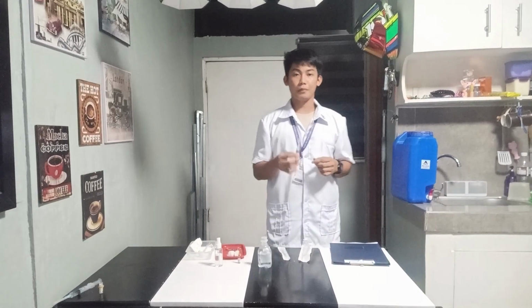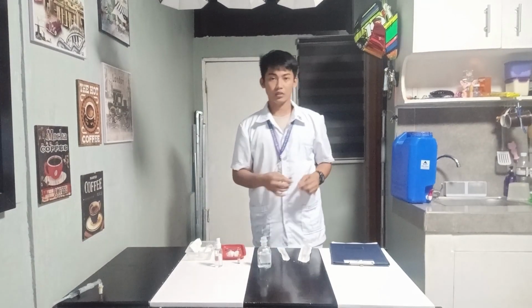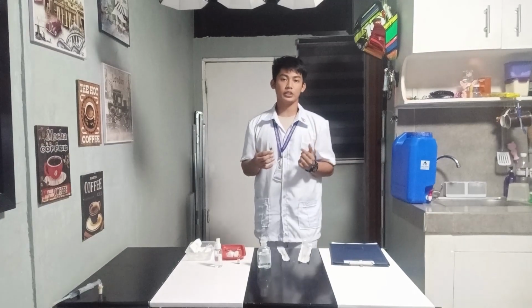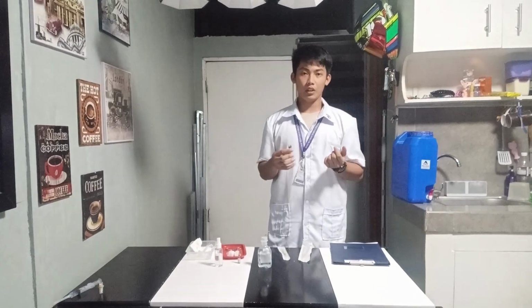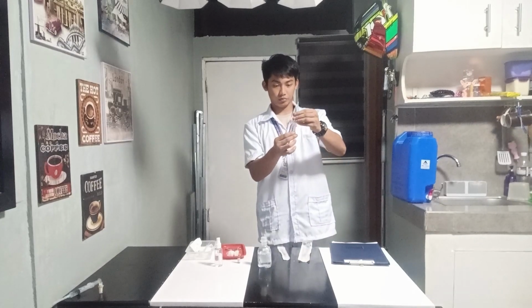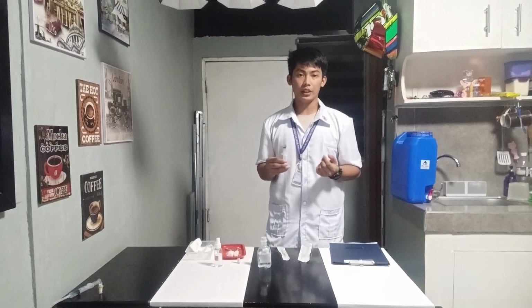So remove the cap from the needle. Then draw up into the syringe an amount of air equal to the volume of the medication to be withdrawn. So now carefully insert the needle into the upright vial through the center of the rubber cap, maintaining the sterility of the needle.